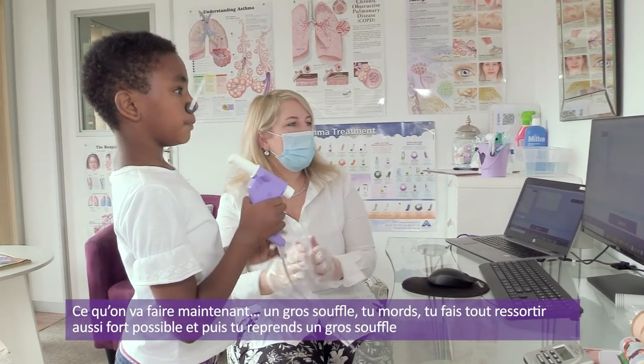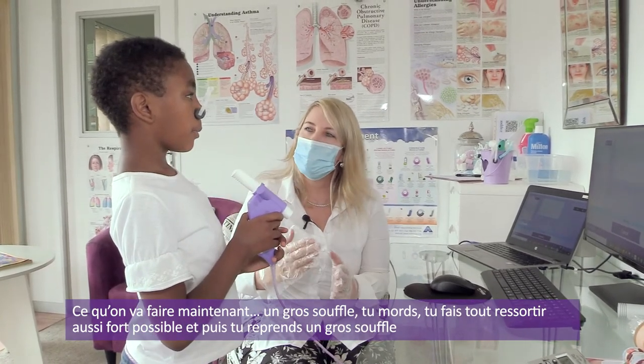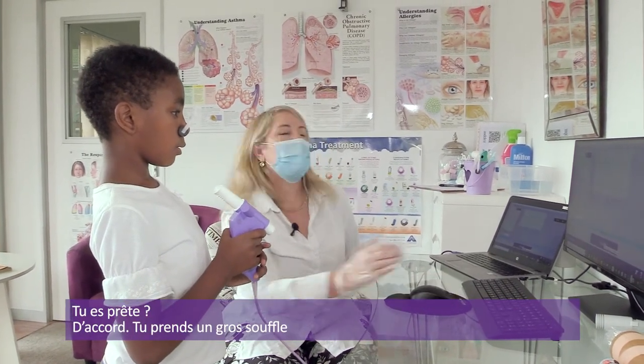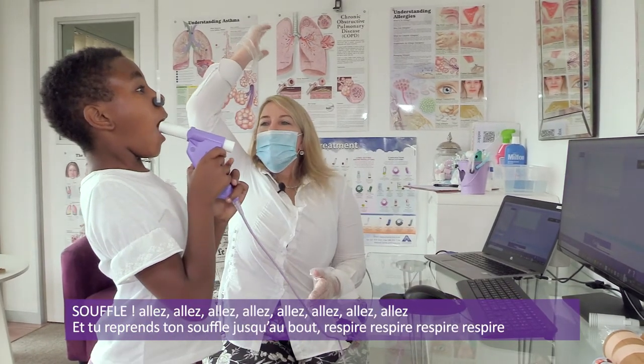All right. So what we're going to do now is take a deep breath in, bite your teeth on, blast the air out for as long as you can, and then breathe in all the way at the top, at the end. Okay. Let's just get started again. Are you ready? Yeah. Okay. Take a nice deep breath in. Okay. Go.